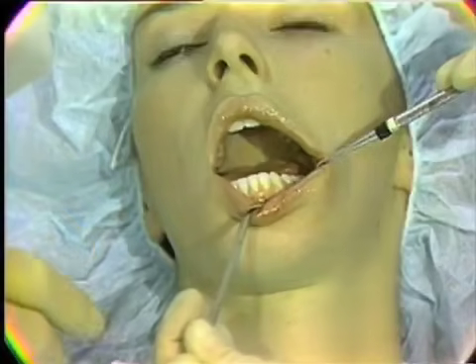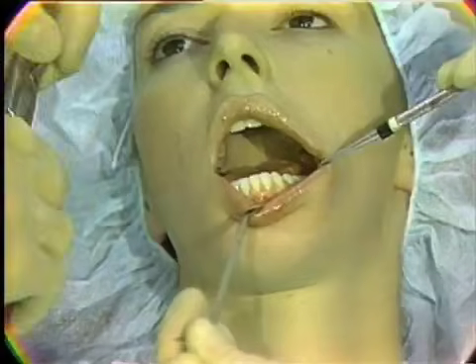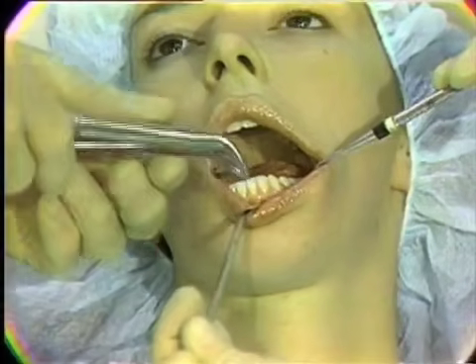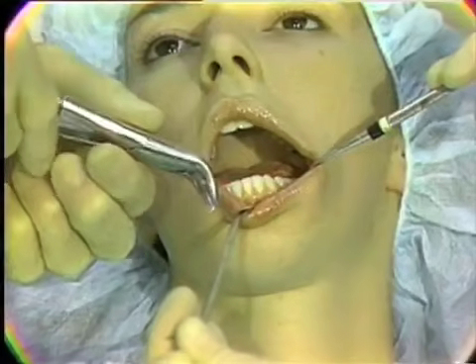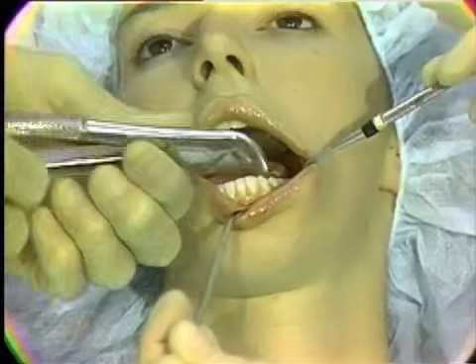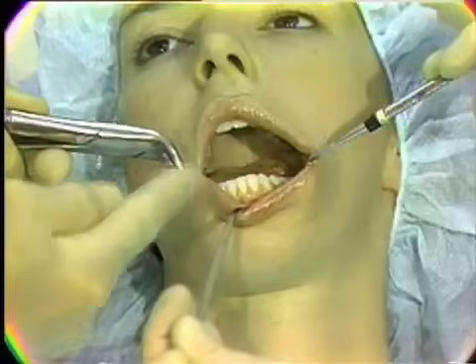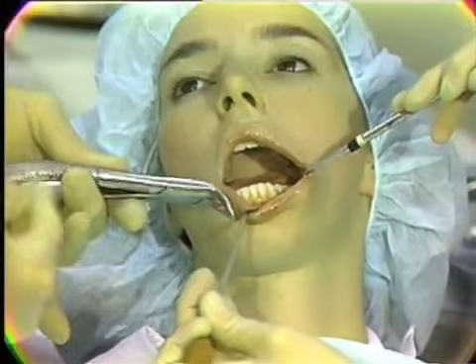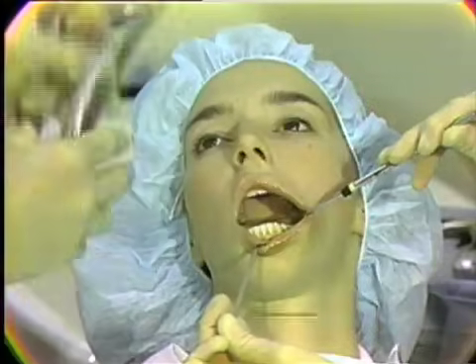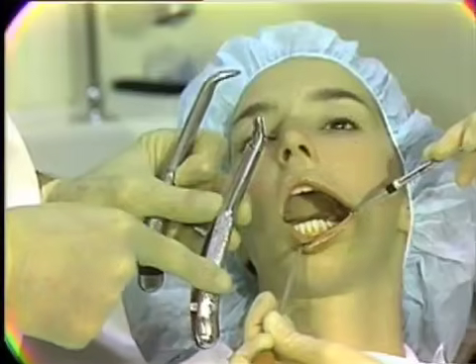After we had obtained preliminary mobilization of the tooth in question, we would then apply the forceps. Forceps are designed so that the beaks of the forceps should be in the same long axis of the roots of the teeth. Consequently, the lower forceps has a more or less right angle position to the beaks as compared with the handles, whereas the maxillary forceps tends to have a more linear relationship between beaks and handles of the forceps.